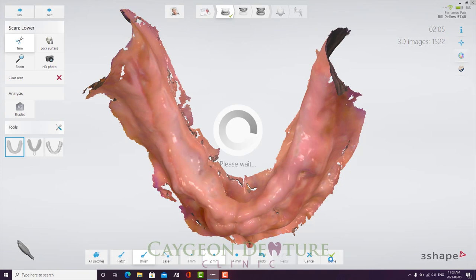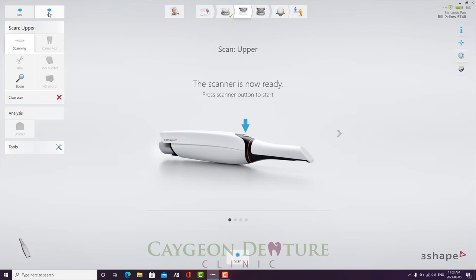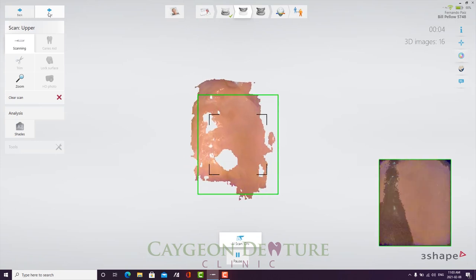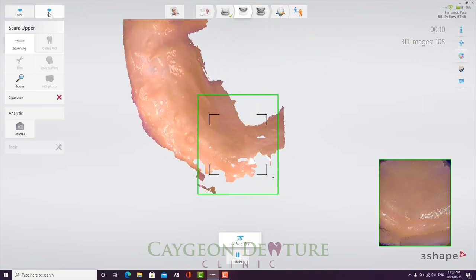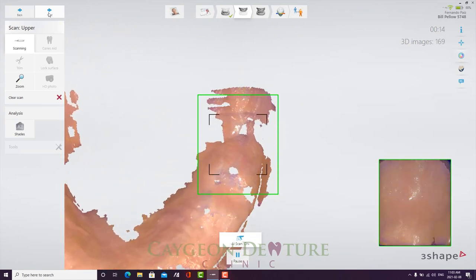Once I'm satisfied with how the lower scan looks, then I can go ahead and move on to the scanning of the upper denture. Scanning of the upper denture is a lot easier than scanning tissue. Of course, I have to make sure to scan the occlusal side of the teeth, as that is what my lower denture teeth are going to be occluding against.